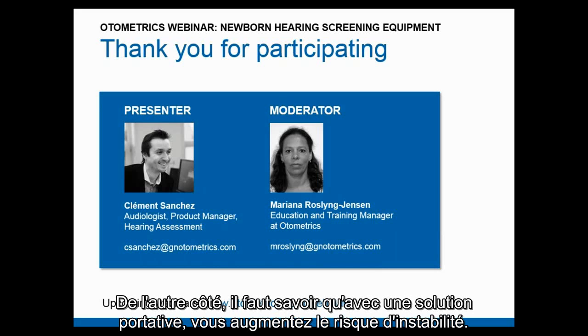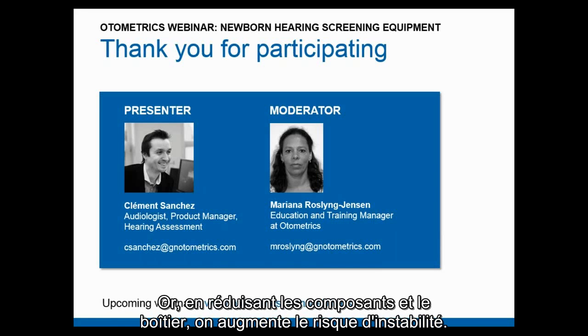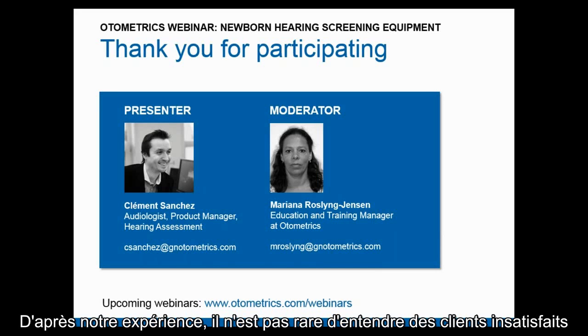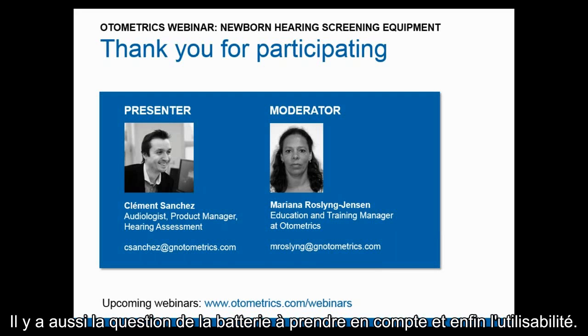But on the other hand, having something portable, you need to know that you will increase the risk of instability. I said that the components have to be reduced to the minimum, as we have seen for the pump, for example, and reducing the components and the housing will increase the risk of instability. It's not rare to hear, and we also had this experience, that customers are getting unhappy because they have some troubles with the pump or with the probe because it's too sensitive, but also the battery, that's something we need to consider. And finally, the usability.